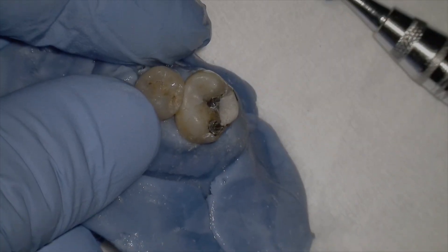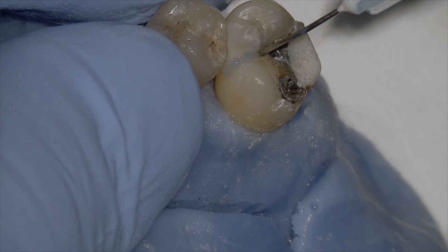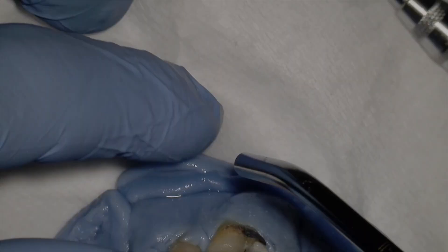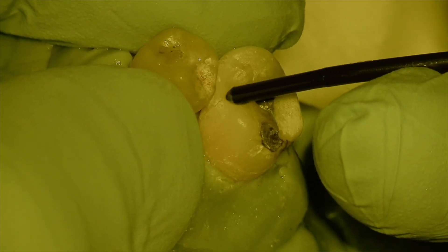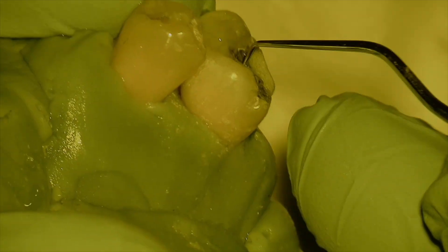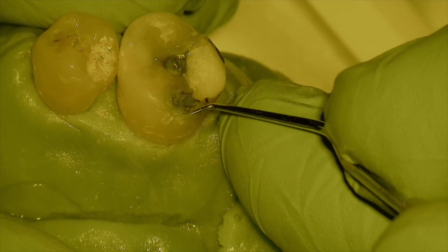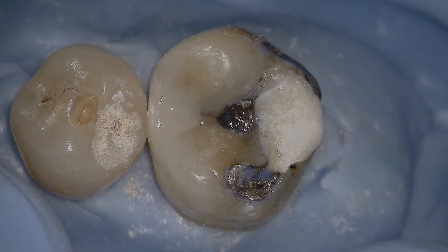Use an enhanced polishing cup with plenty of water for the final polish. Then, as a finishing touch, etch the enamel for 15 seconds, air dry, and flow a sealant over the margin between the restoration and tooth structure to seal it. Cure it, and you have your finished restoration. Current literature even supports sealing in old restorations without decay as a viable approach.